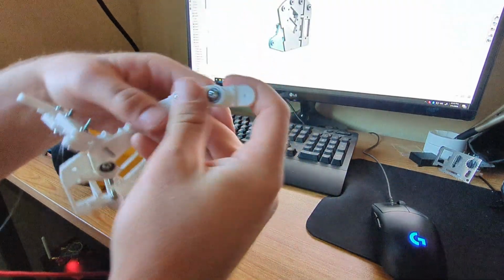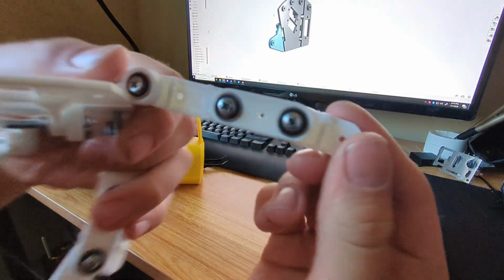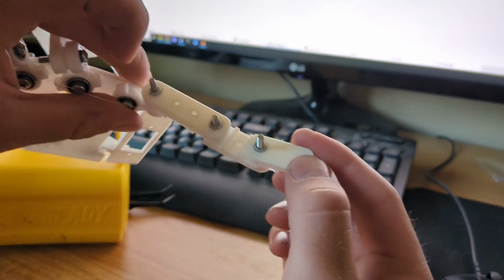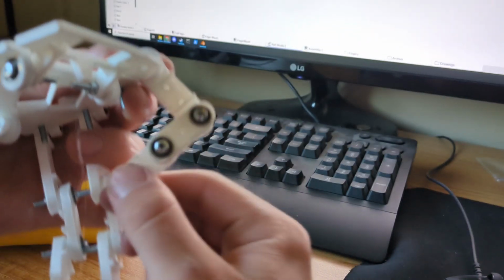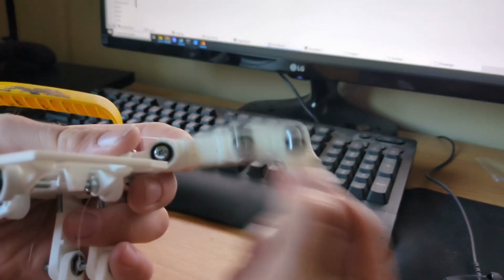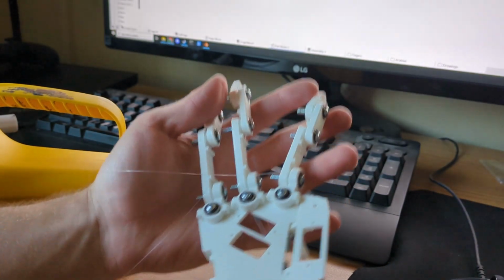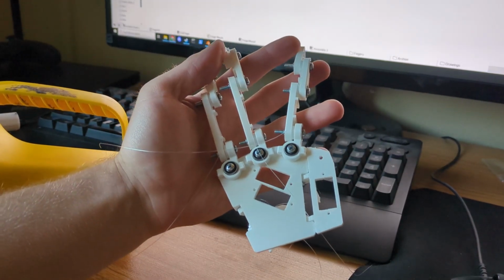Only other thing to look at, if we really look at the finger here, you can see it's screws, bearings, and nuts. That's it. These are fairly cheap components. Fishing line was like $8. You can get all the hardware for probably around 30. So currently the bill of materials is very, very low. Motor's gonna be a little more expensive. I'm gonna have to figure out how that's gonna work.